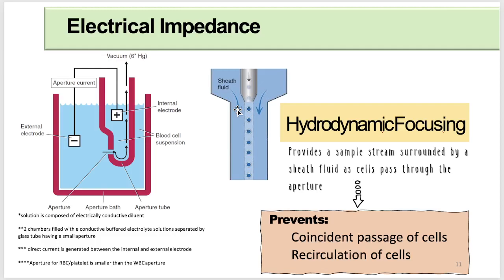So I guess we were able to address the problem of a possible protein buildup through your hydrodynamic focusing because, diba, may sheath fluid tayo na naka-surround. I hope that's clear.